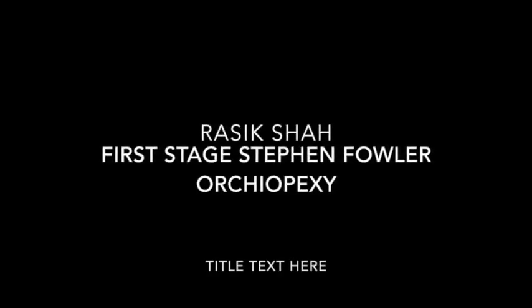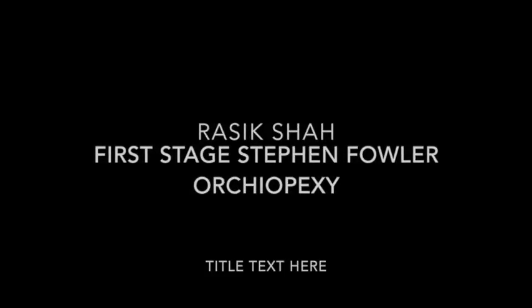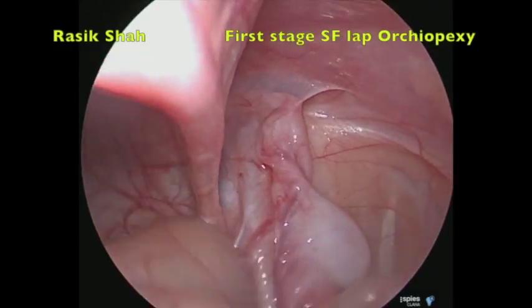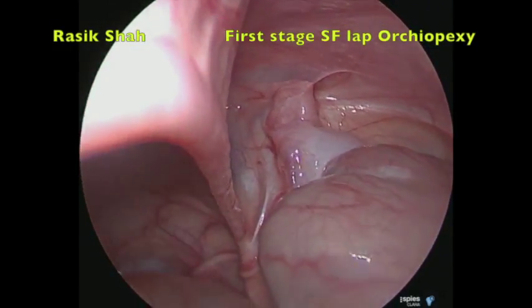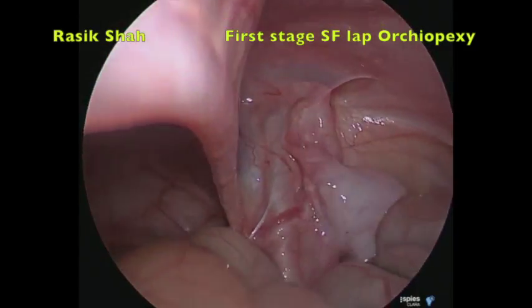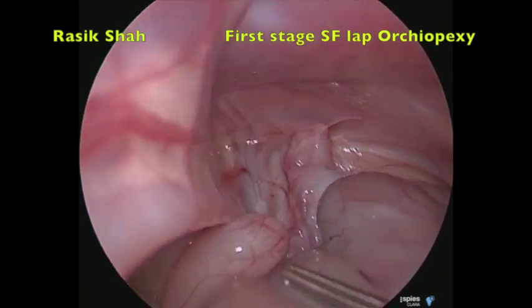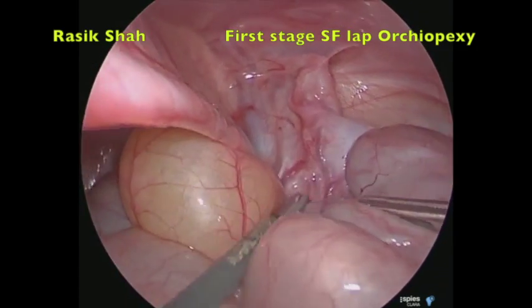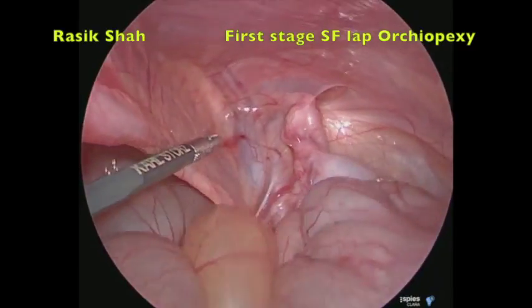Friends, we are going to discuss non-palpable undescended testes. This is a one-and-a-half year old boy who presented with right side non-palpable testes. Diagnostic laparoscopy was performed using a 5 mm 30-degree scope through the umbilicus and two 3 mm ports in a para-umbilical region in the mid-clavicular line. The first thing is the assessment.